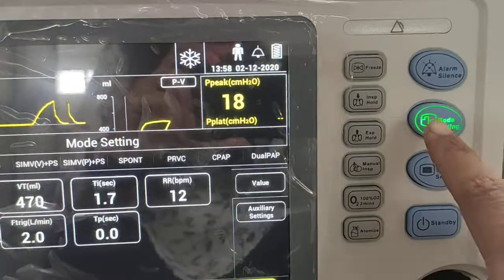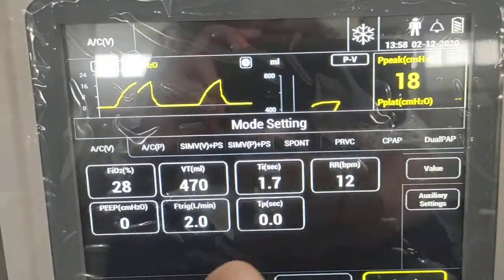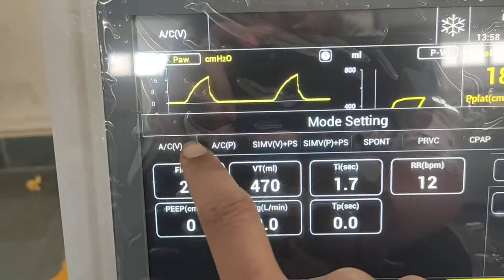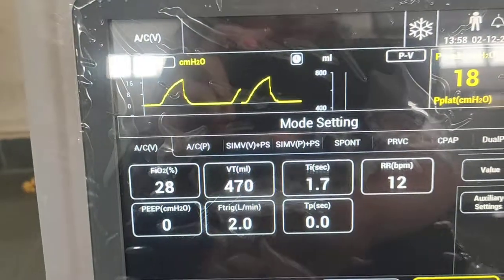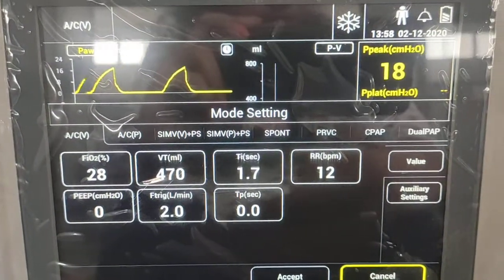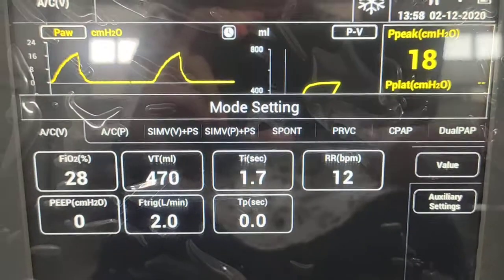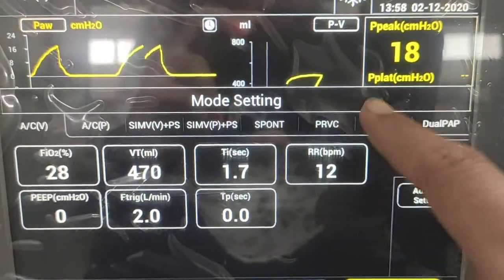In the mode settings, different ventilation modes are available. Assist Control V and Assist Control P are the VCV and PCV mandatory modes respectively. Pressure support modes are also provided, along with spontaneous modes including CPAP and BiPAP, and the PRVC mode is also available.